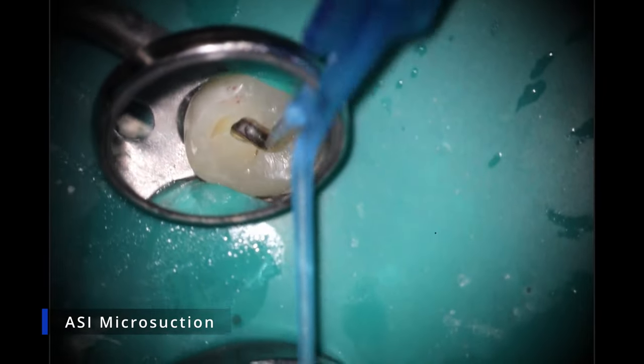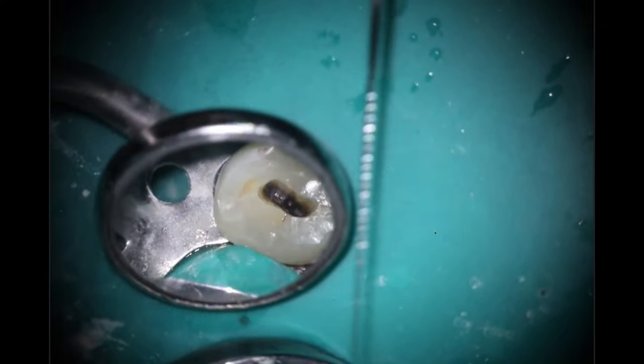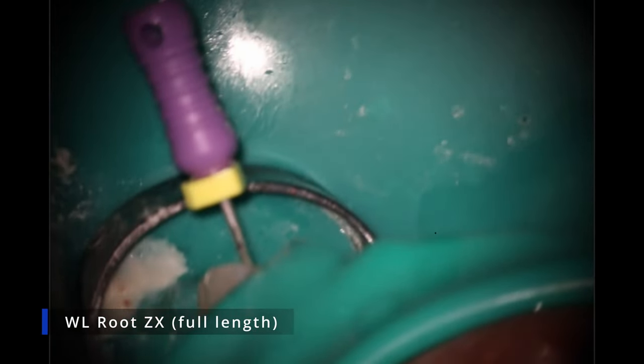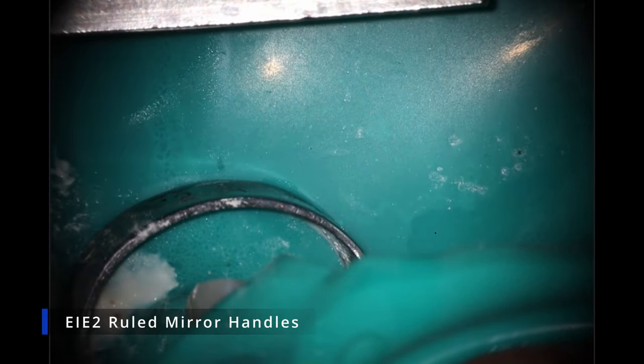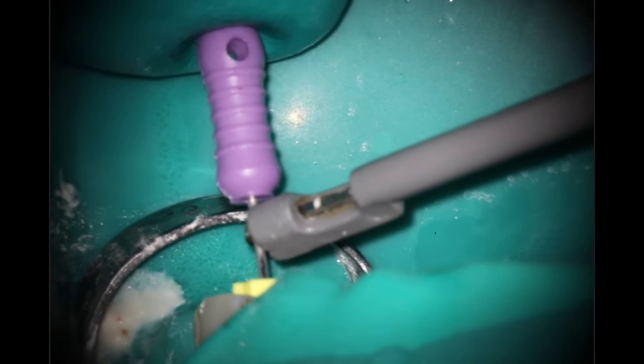We're ready to get length — we've figured out how many canals there are, cleaned up the top part, and it is length time. For length, I like to dry it as best as possible using that micro suction. I'm using the Root ZX from Morita with a 25-length 10K file to get length. I like to go to full length — pulling right back from where the red indicator is. I found that the 0.5 back can be very variable, and the zero tends to be the most accurate. My lengths have been a lot better since making that change recently.